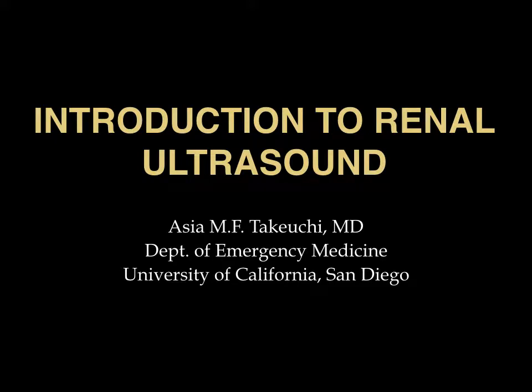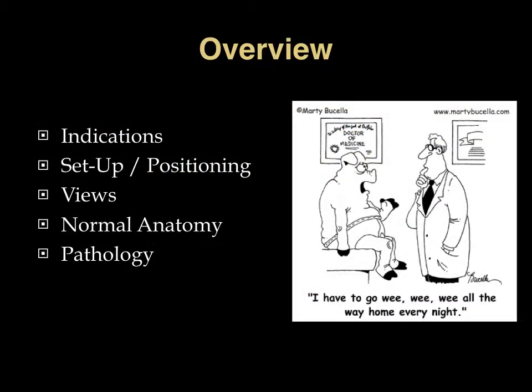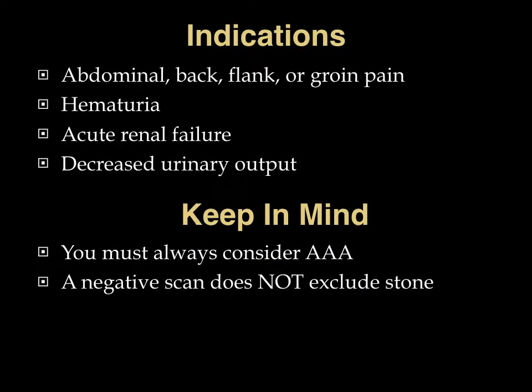Hello, my name is Asia Takeuchi, and I will be taking you through an introduction to renal ultrasound. We will start by discussing the indications for renal ultrasound, then move on to machine setup and patient positioning. From there, we will review the different views you will want to obtain and compare normal anatomy to some examples of common renal pathology.